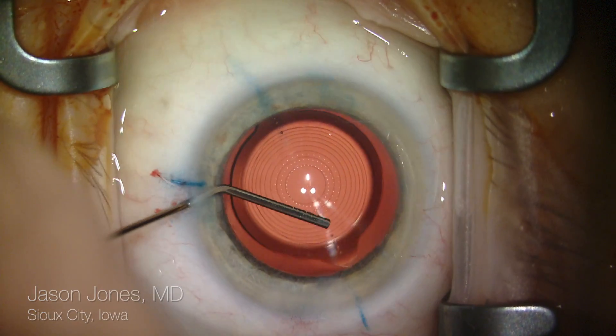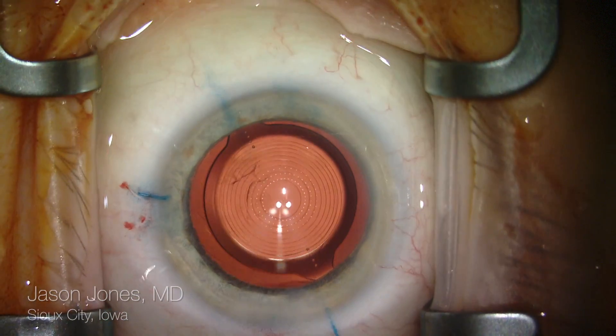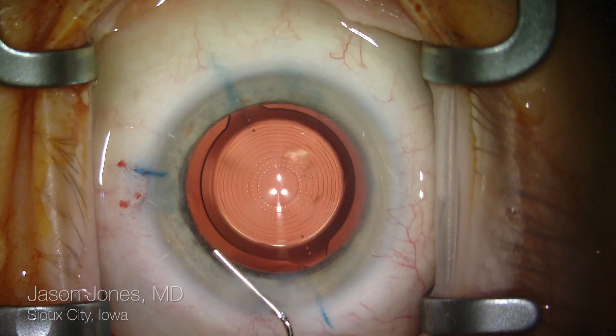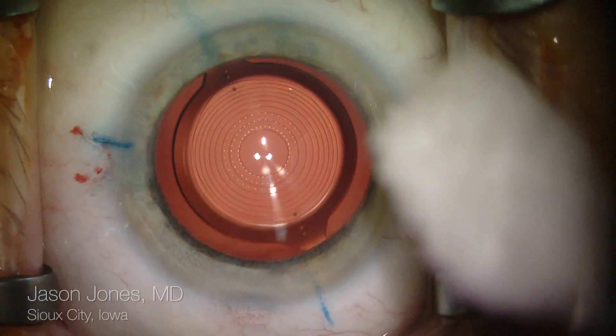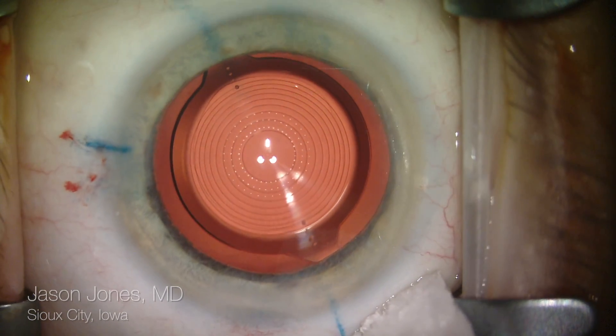I'm also going to observe here for concentric alignment to the ring light array that you see here, and I'm asking the patient to look towards the central fixation light in the center of the optic. This allows for best orientation and an excellent result.